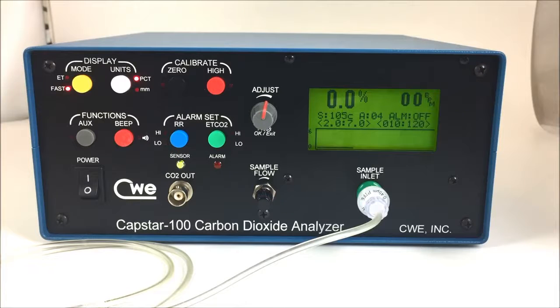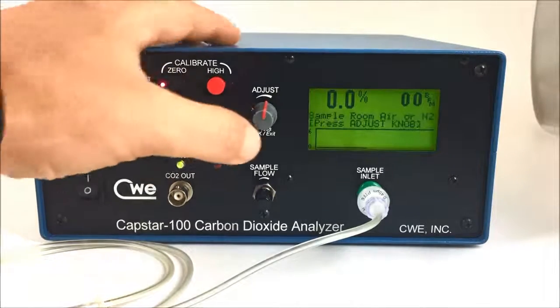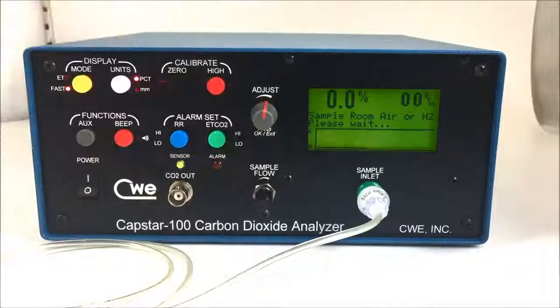Now that the sensor is fully warmed up, we can complete the calibration routine. We start with the zero. While sampling either 100% nitrogen or room air, we'll press the zero and the adjust knob. The Capstar 100 will automatically go through a zeroing routine. That's it for zero.